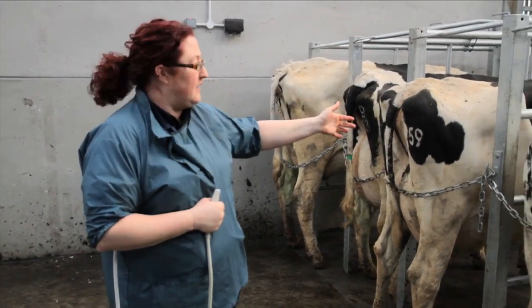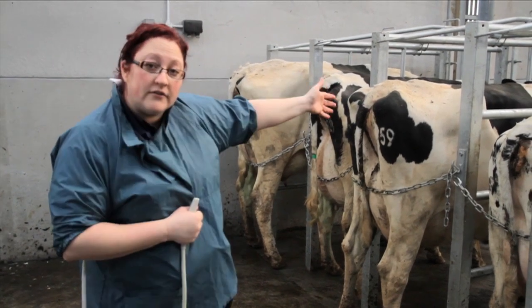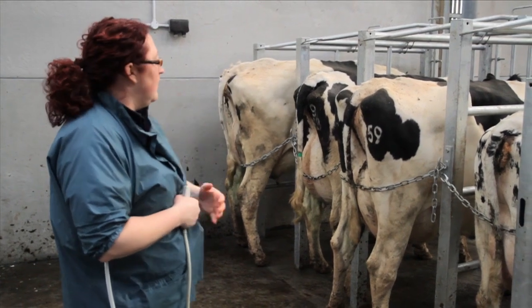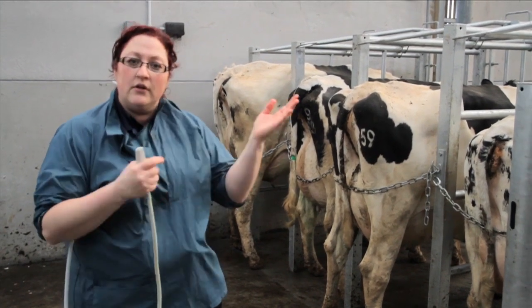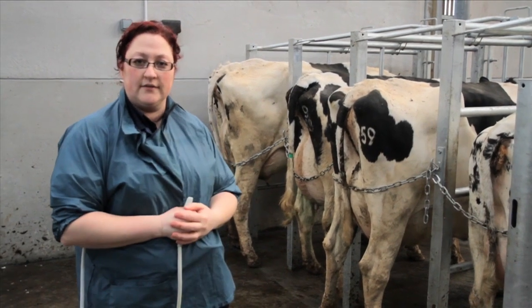In this particular facility, we actually have dedicated stocks, or AI stalls, where each cow can slot in individually, and we have good access to be able to perform our examination. You can also use locking head yokes or individual crush or stock facilities.